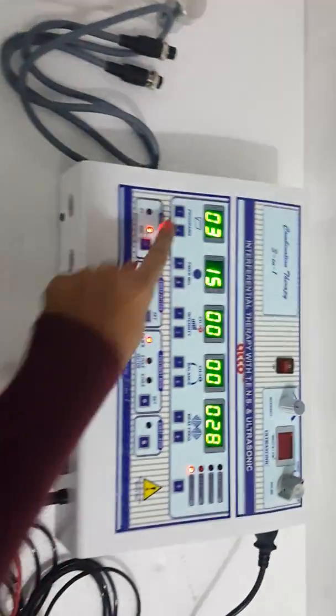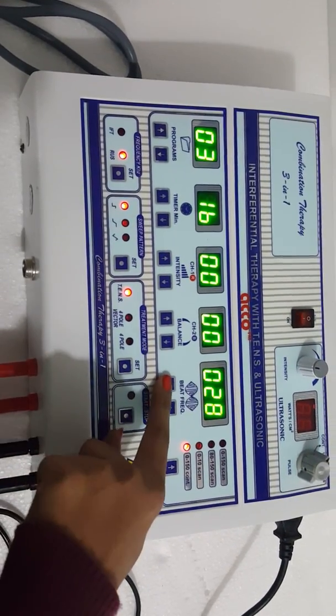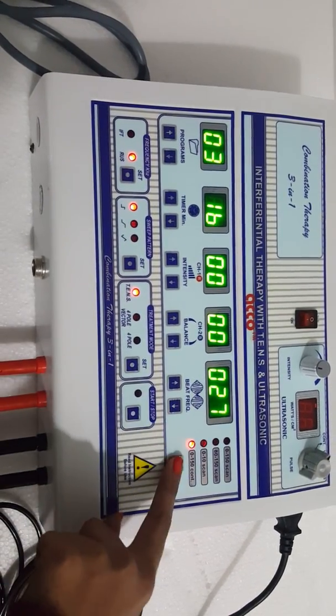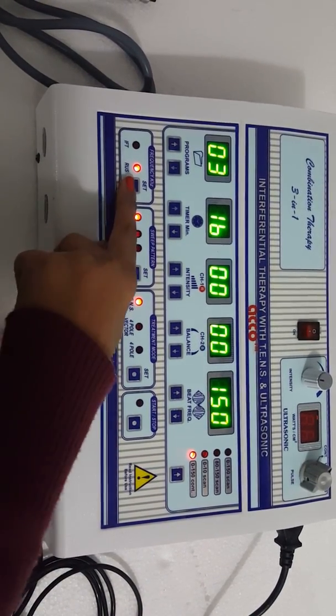Now set the parameters. Set the program as per your need. Set the timer as per your need. Set the beat frequency as per your need. The beat frequency can also be set from here. Now set the frequency in kilohertz.